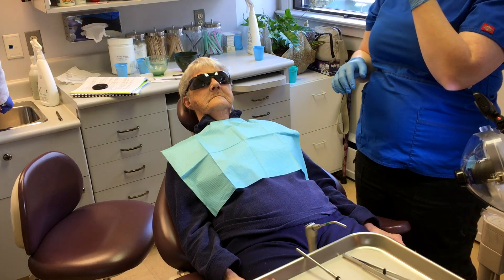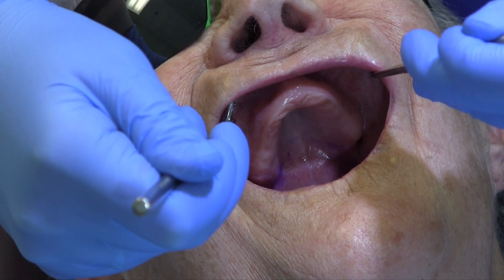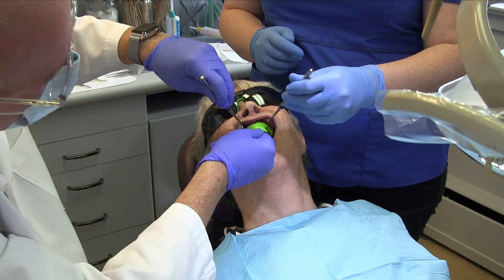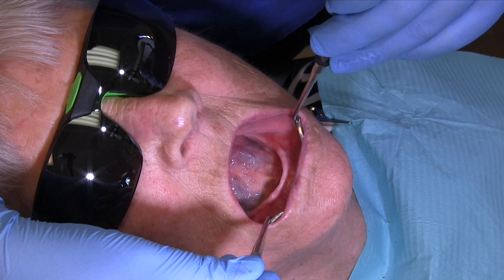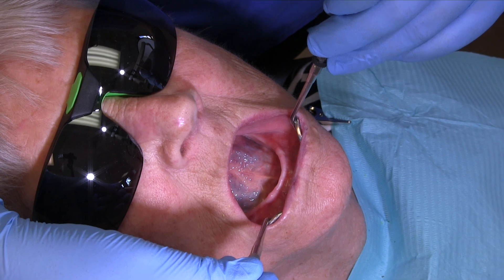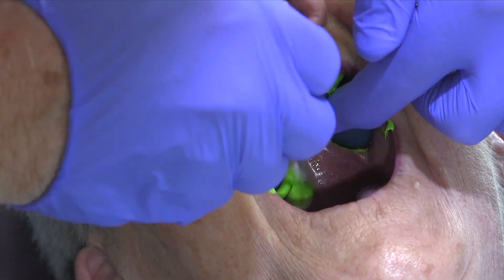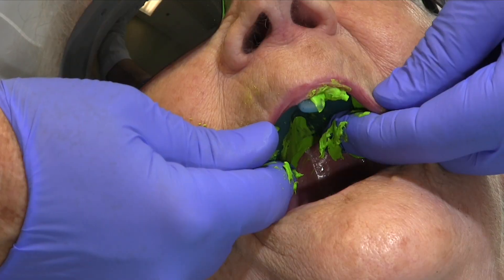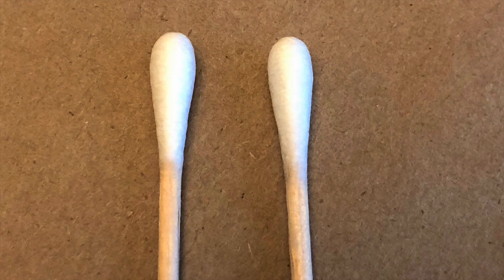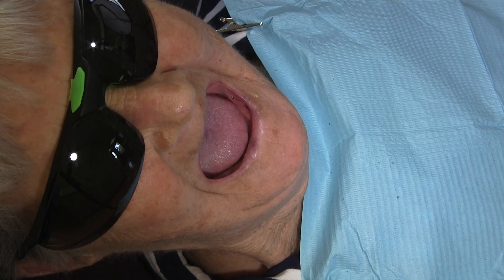Place the patient in a supine or reclined position, which makes visibility easier with the added benefit of being more ergonomically comfortable for the operator. If the patient is fully supine, the tongue will naturally fall to the back of the oral cavity, blocking access to excess impression material at the back of the tray. The vast majority of patients do not have a problem with gagging using this technique. Place a couple of cotton tip applicators on the operator's tray for use during the impression. Instruct the patient to relax their lips and cheeks.